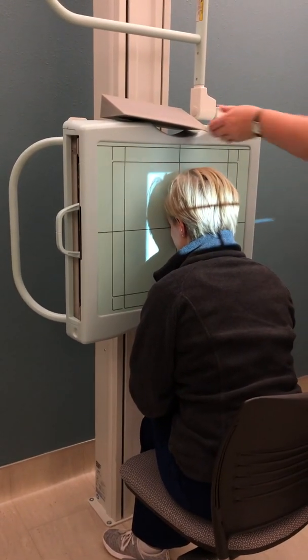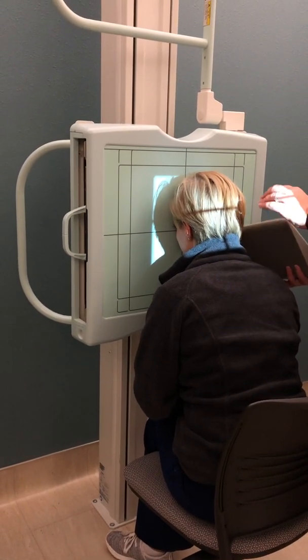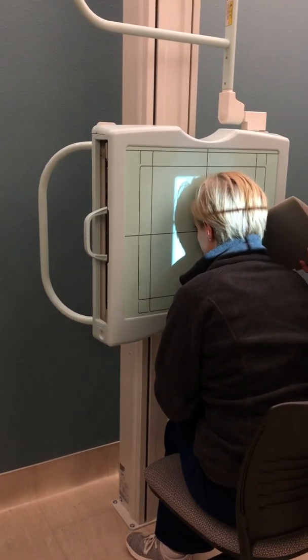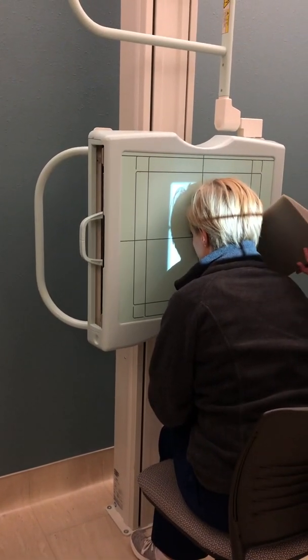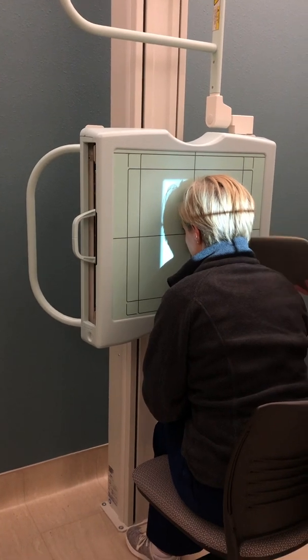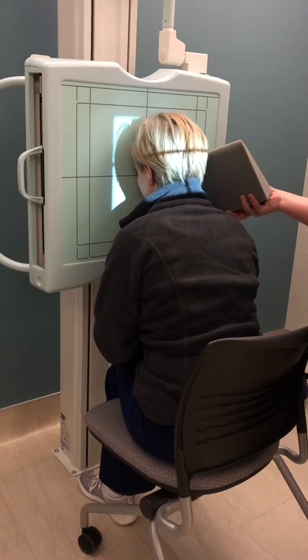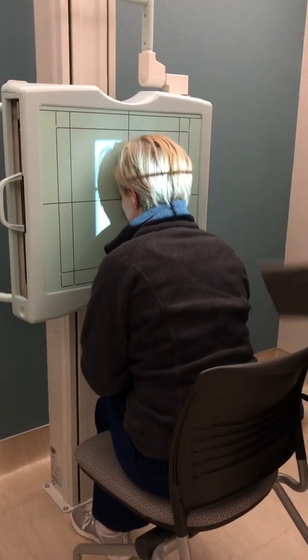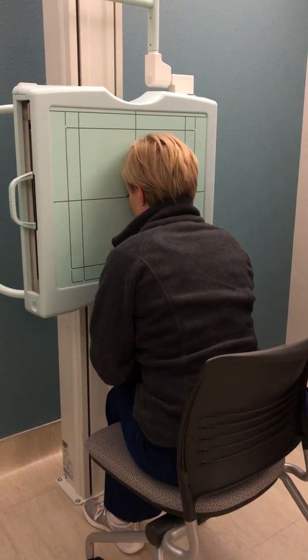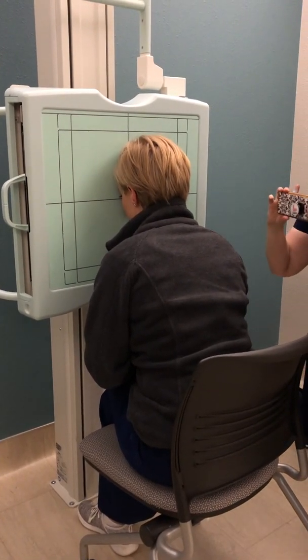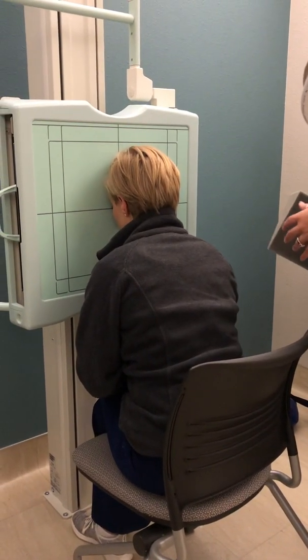How do you tell if the beam is exiting through the nasion? Because I'm following the path of that line. Here's the OML perpendicular, and here's the line of the beam — it's a drawing. Get down on the level of your patient so you can truly evaluate.